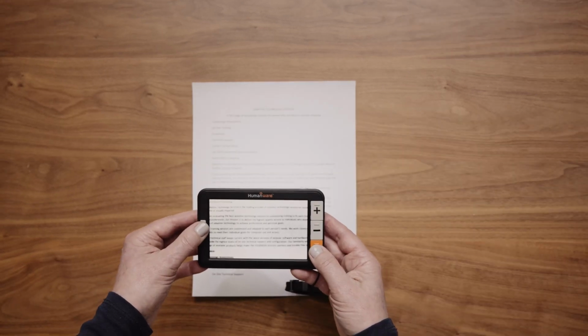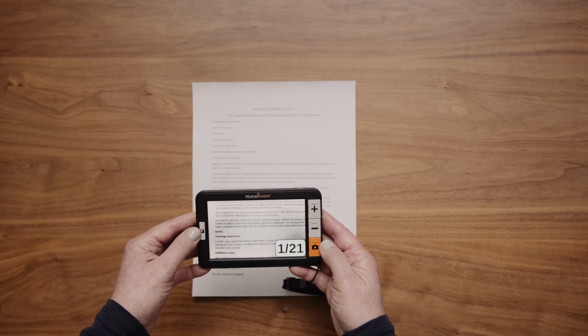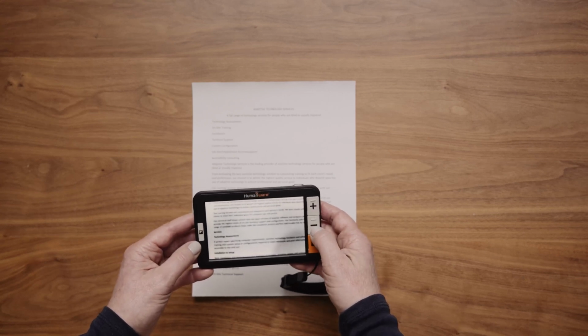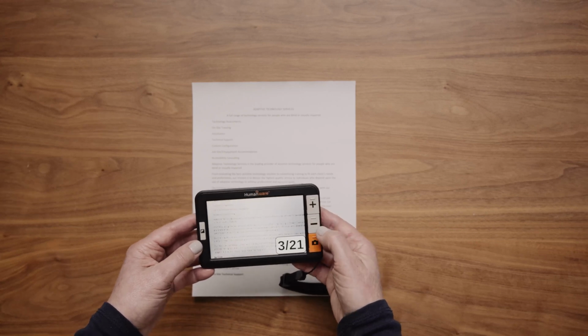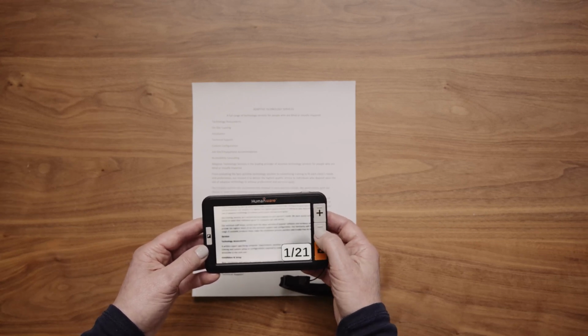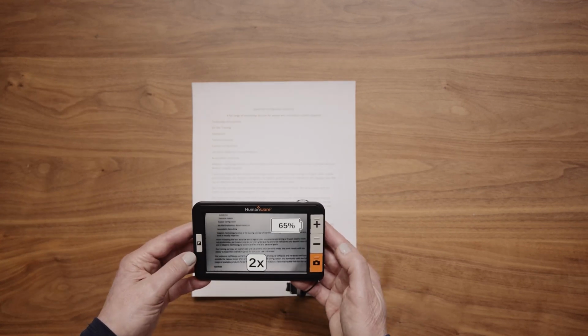1. Press and hold the contrast and freeze buttons simultaneously to enter gallery mode. 2. Press the Zoom In plus or Zoom Out minus button to cycle through the saved images. 3. Press the contrast button to exit gallery mode.